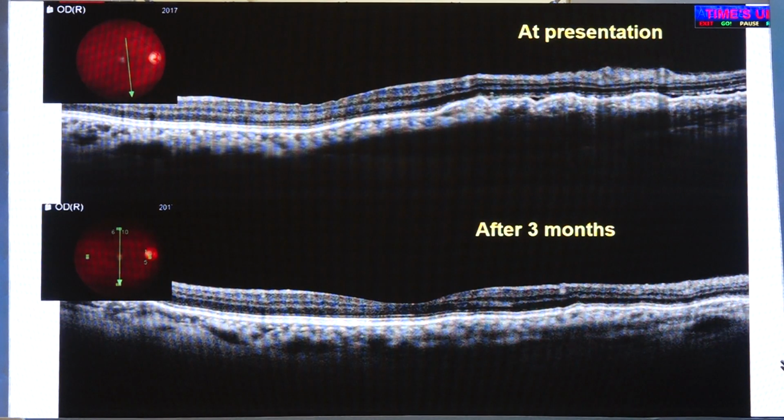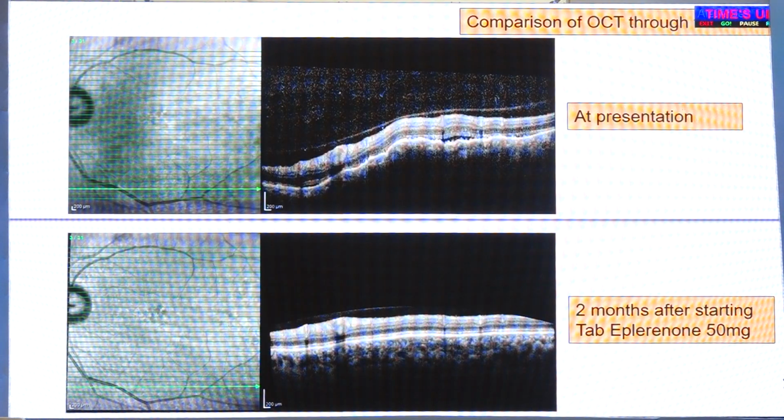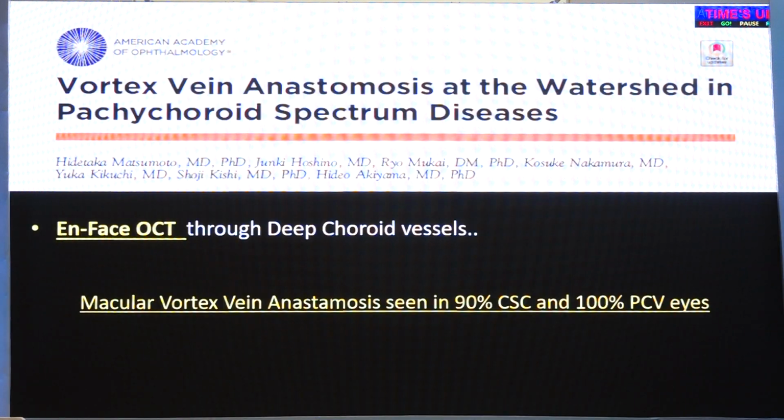Another patient, again, posterior choroidal loculation of fluid, and you can see that lumpy, bumpy choroidal elevation like a metastasis, choroidal metastasis. But then with eplerenone, this patient's choroidal loculation has disappeared, mimicking a posterior choroidal mass lesion. It's a rare finding or biomarker in CSC.